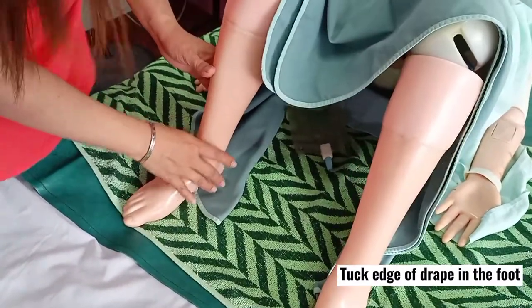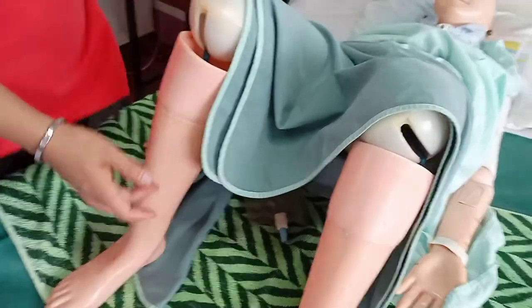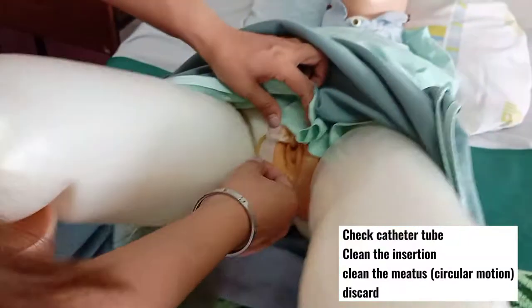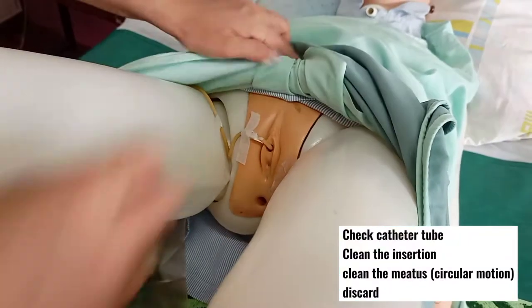Check the integrity of your tube by pulling it gently.